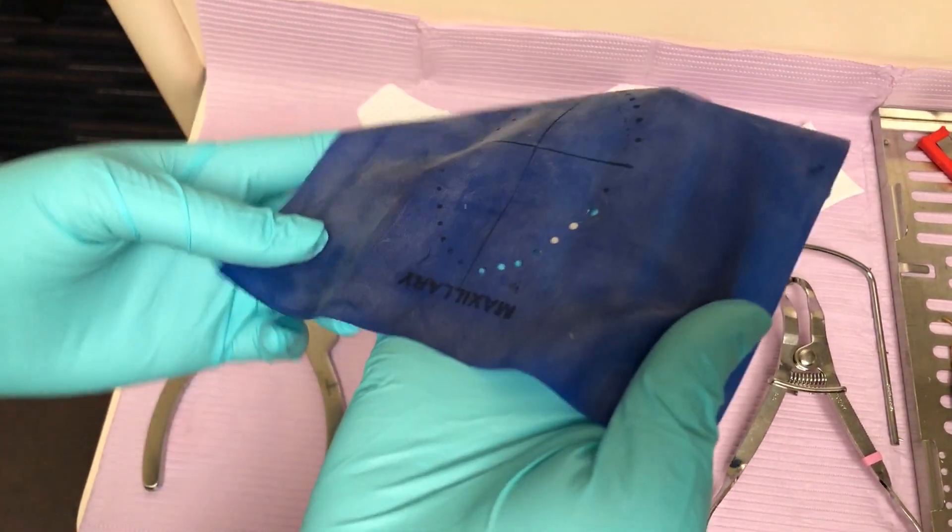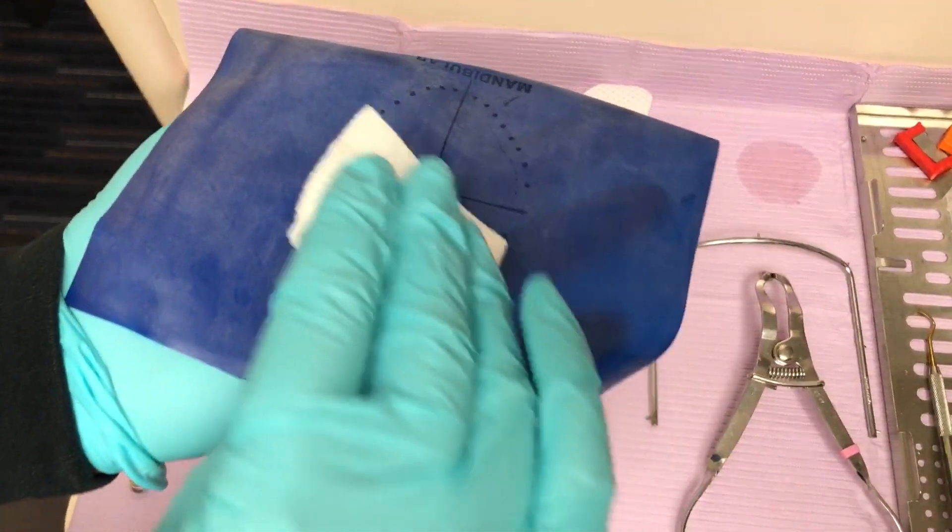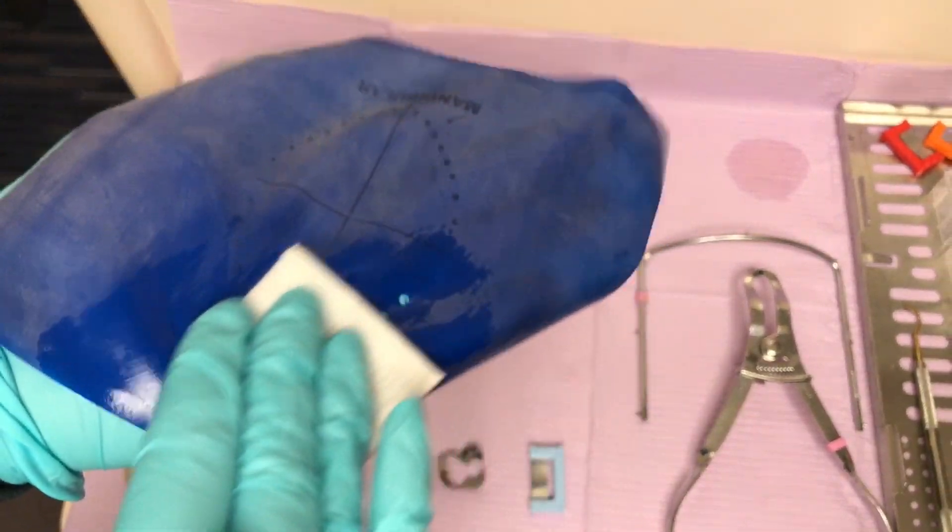Then with a 2x2 that has isopropyl alcohol, or rubbing alcohol, on it, I wipe the stamped ink off of the rubber dam.